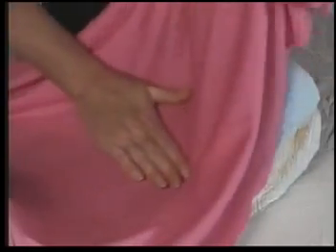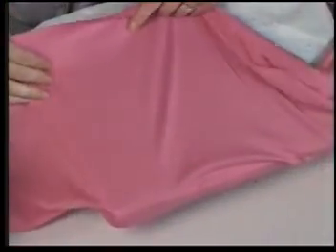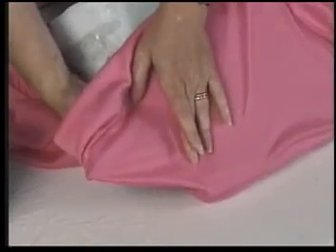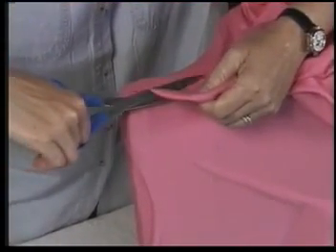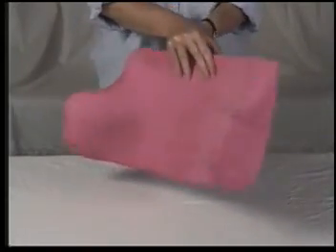Working with the stretch of the fabric, seams can be totally avoided on the inner contour of the insert, thus avoiding ridges or pressure points. To make the seam, apply adhesive to the foam surface and pinch the fabric ends together with your fingertips. Let the seams dry completely. Then, trim the excess fabric with scissors to create smooth, flat seams. Repair any that have come open during trimming. The cushion is now ready to waterproof.